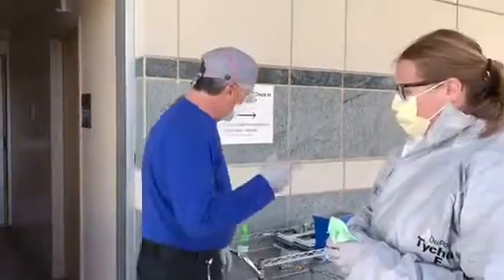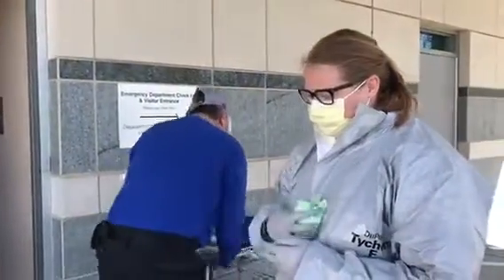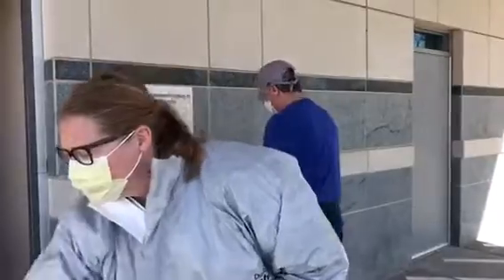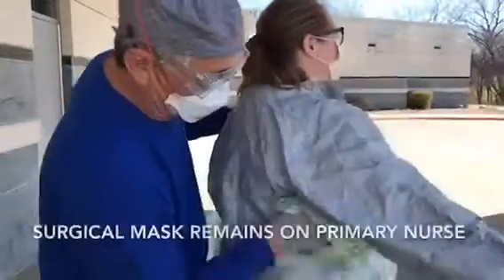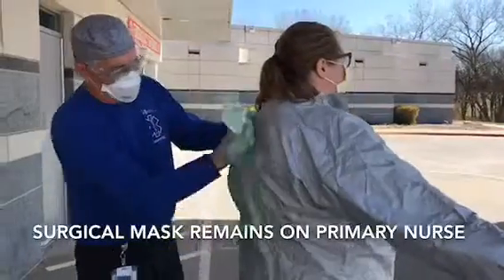The secondary nurse will take another rag and wipe off the backside of the primary nurse. Please note that the primary nurse still has a surgical mask on. This is to protect her from any other respiratory illness.